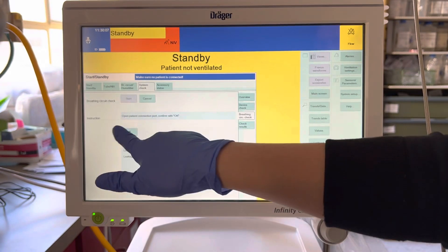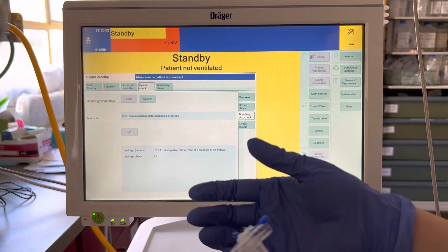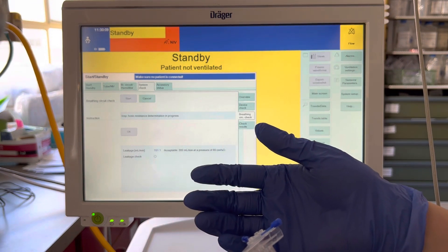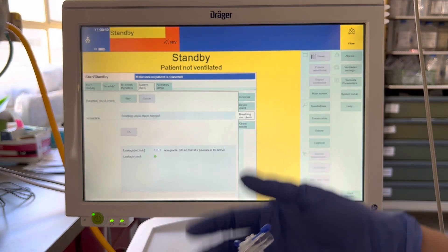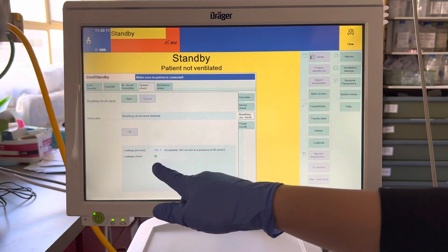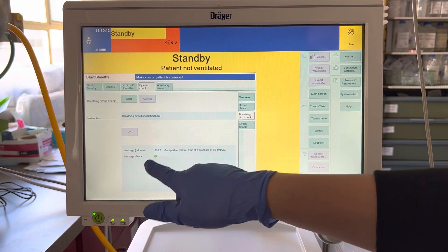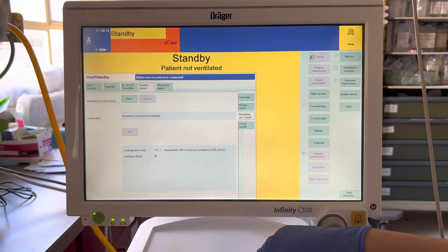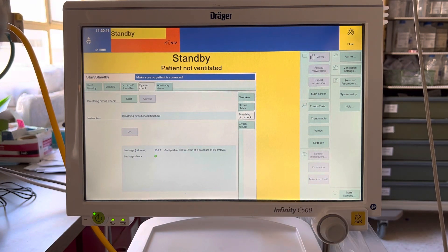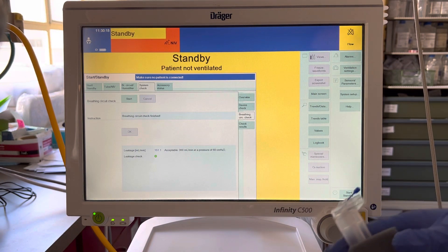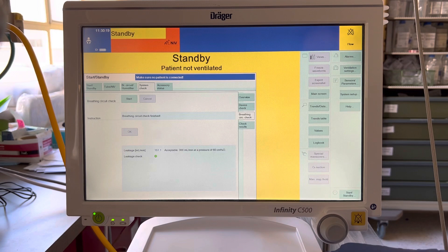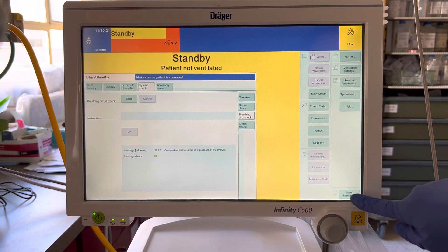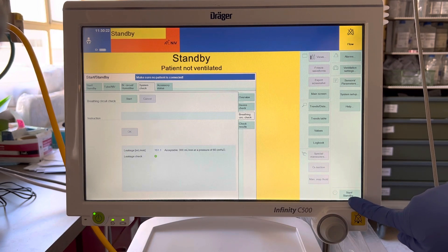Now you've reached the leak check and you see a green light. Once you get the green light, we're going to go back to start and standby.